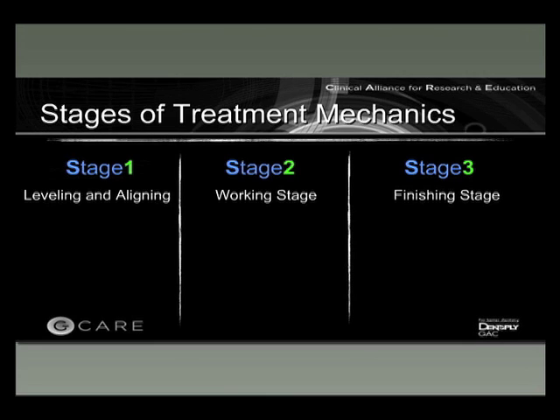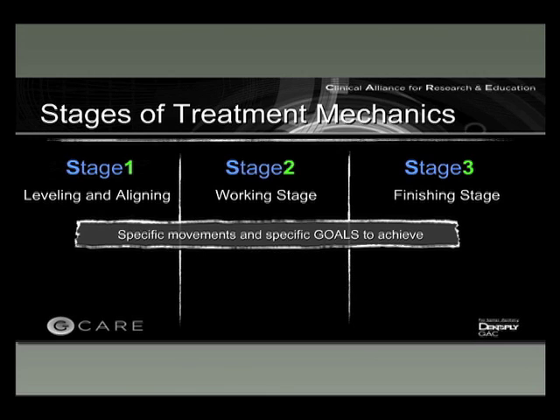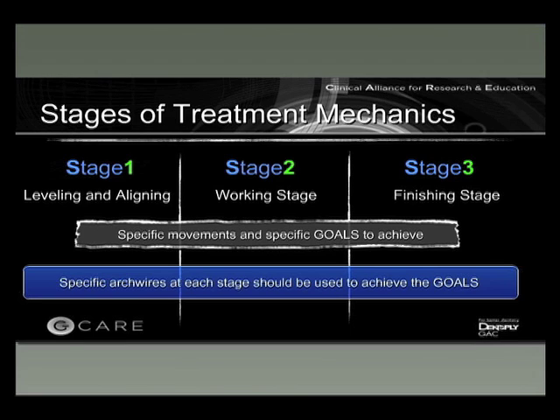What is really important to emphasize at this point is that every single stage has goals that you need to achieve before going to the next stage. Those goals need to be really clear, and the movements that happen in one stage are different from the ones that happen in the next stage. Also, there are specific arch wires at each stage that you should use to facilitate achieving those goals.